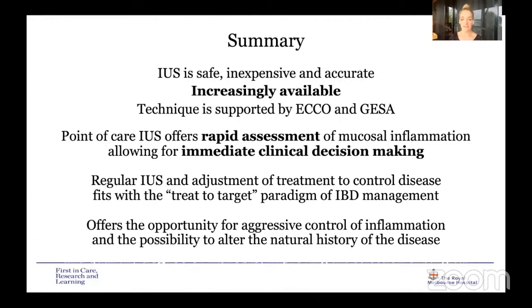It offers rapid assessment of mucosal inflammation and allows for immediate clinical decision making. Regular intestinal ultrasound with adjustment of treatment to control disease fits with our treat to target paradigm of inflammatory bowel disease management. It offers the opportunity for aggressive control of inflammation and the possibility to alter the natural history of the disease.